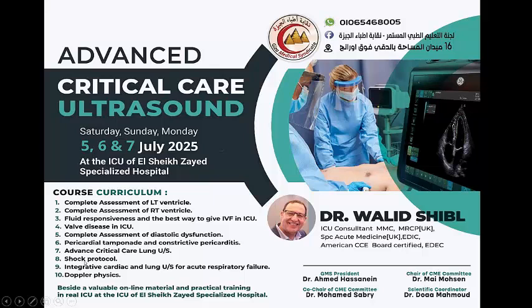And also in our course, you will know about the importance of valve lesions in ICU, and you will know about the diastolic dysfunction, how to determine the left atrial pressure to differentiate between cardiogenic and non-cardiogenic pulmonary edema. It's very important. And you will know about advanced lung ultrasound, the role of lung ultrasound in recruitment in ARDS, and pericardial tamponade, constrictive pericarditis, shock protocol, and the integrative approach of cardiac and lung ultrasound for acute respiratory failure.